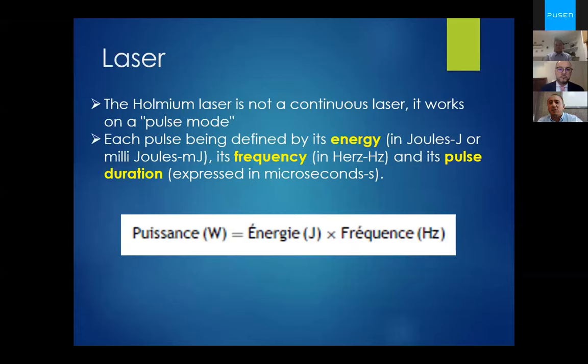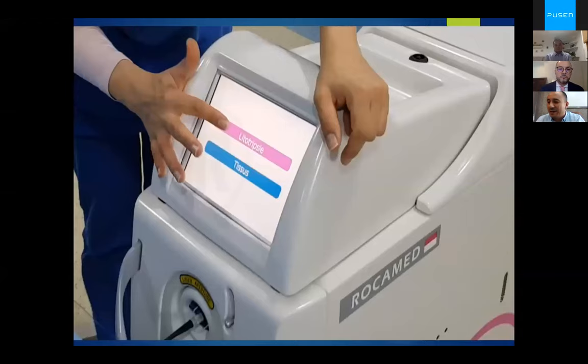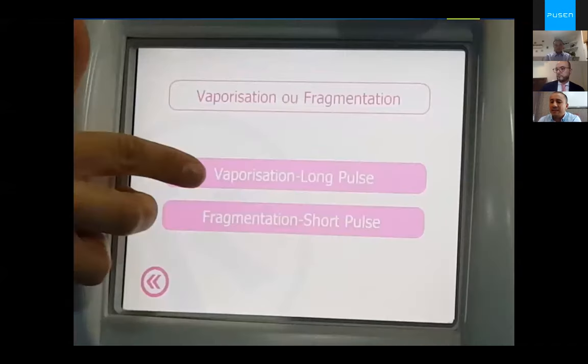The holmium laser is not a continuous laser. It works in a pulse mode, each pulse being defined by energy, frequency, and pulse duration. Which parameters to use? What combinations? This is the question. In our unit, thanks to Rocamed, our laser that we are using takes our life easy with predefined parameters. We just choose stones or tissue, and then we choose the shape of the stone, and then we choose dusting or fragmentation.